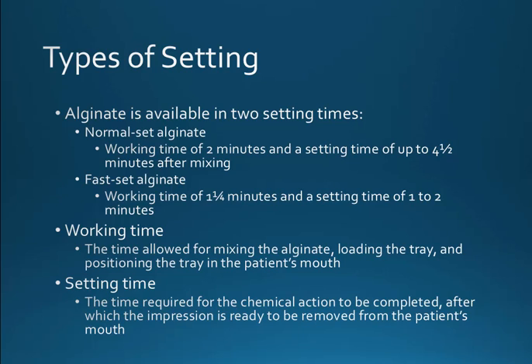So, what do we mean by working time versus setting time? Working time is the time that allows you to mix the alginate, load the tray, and position it into the patient's mouth. And the setting time is the chemical action that takes place. So, it's definitely a good idea to know the type of material that you're working with, to know how much working time and setting time you have.